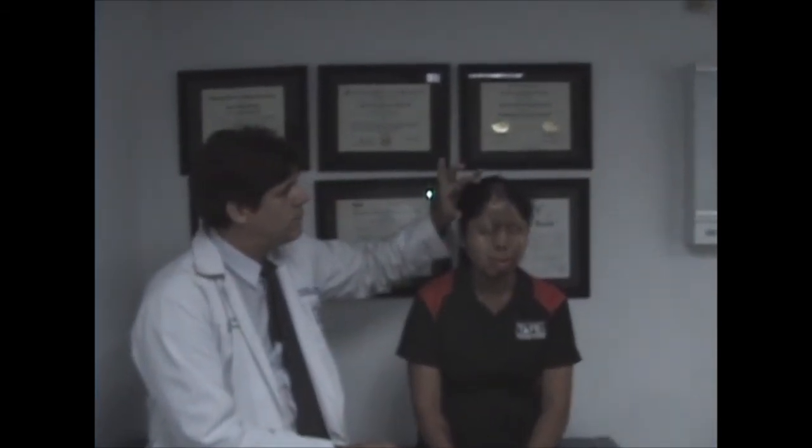And then as we do the injections now, like I said, we're going to do injections where we stretch the skin, and that will be a little bit uncomfortable because it will stretch her scalp, but she will be the boss there and she'll tell us when it begins to hurt a little bit, and we will stop injecting when it gets painful, maybe even take a few cc's out to relax it a little bit, but slowly we'll stretch the scalp without it being too uncomfortable for her.